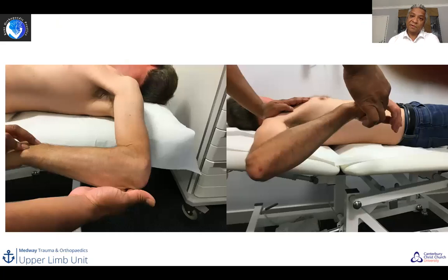So I always perform this in supine position, and this is probably the only time when I do an assessment of a shoulder in supine position. Typically it would be a young male patient who gives a history of overhead workout or sports, coming with shoulder pain. And typically these patients respond very well to capsular stretching.